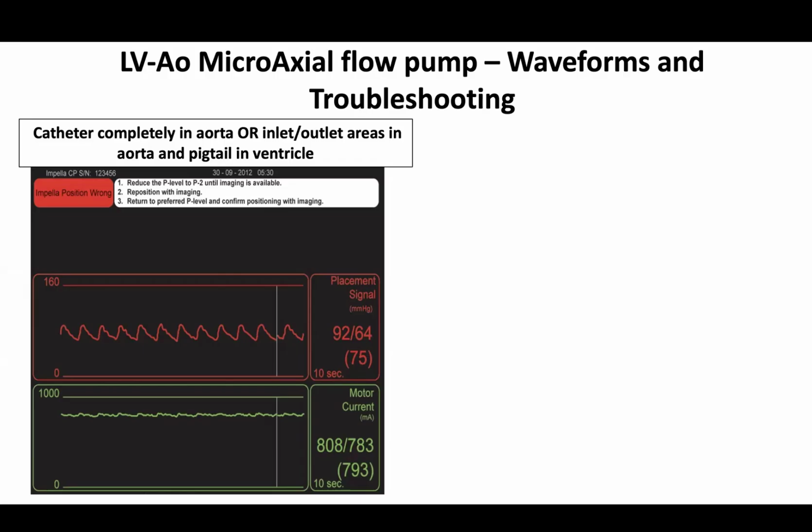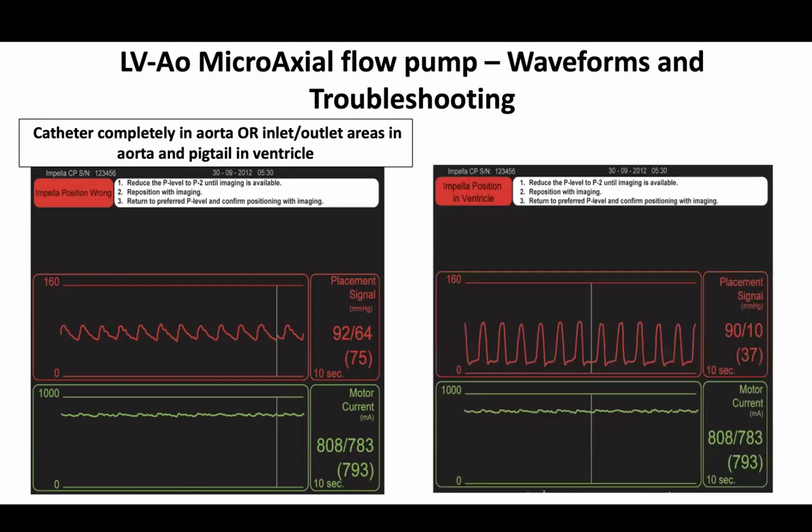So I think what I will propose, and this is part of the proposal, is that we will never reposition this at the bedside. This is something that should be done in the cath lab under fluoroscopy. There are some programs that do it at the bedside. The concern being, and I'll show you one of the few Impellas that I've done here. In the unit, the patient's been turned, and then I get called. This is what we're seeing. And you saw that case too, right? So I'll show you.